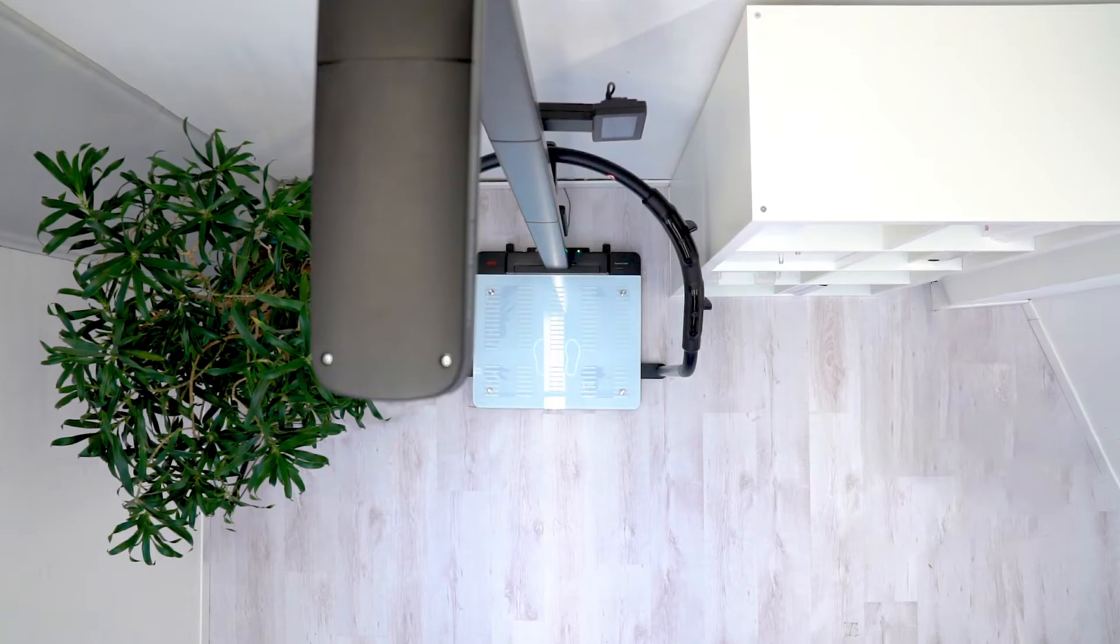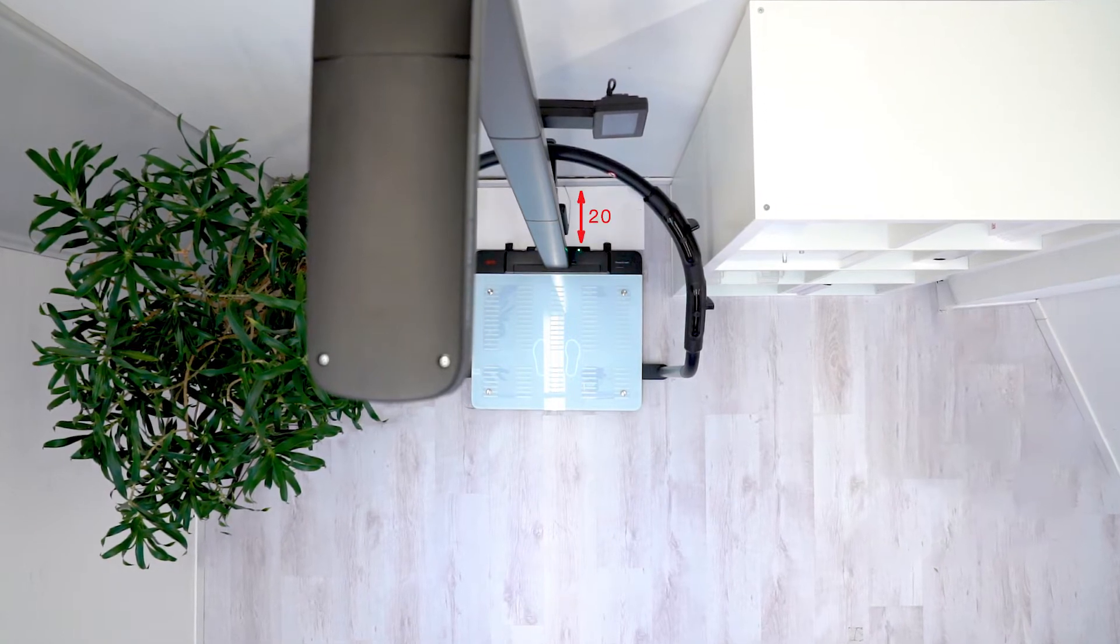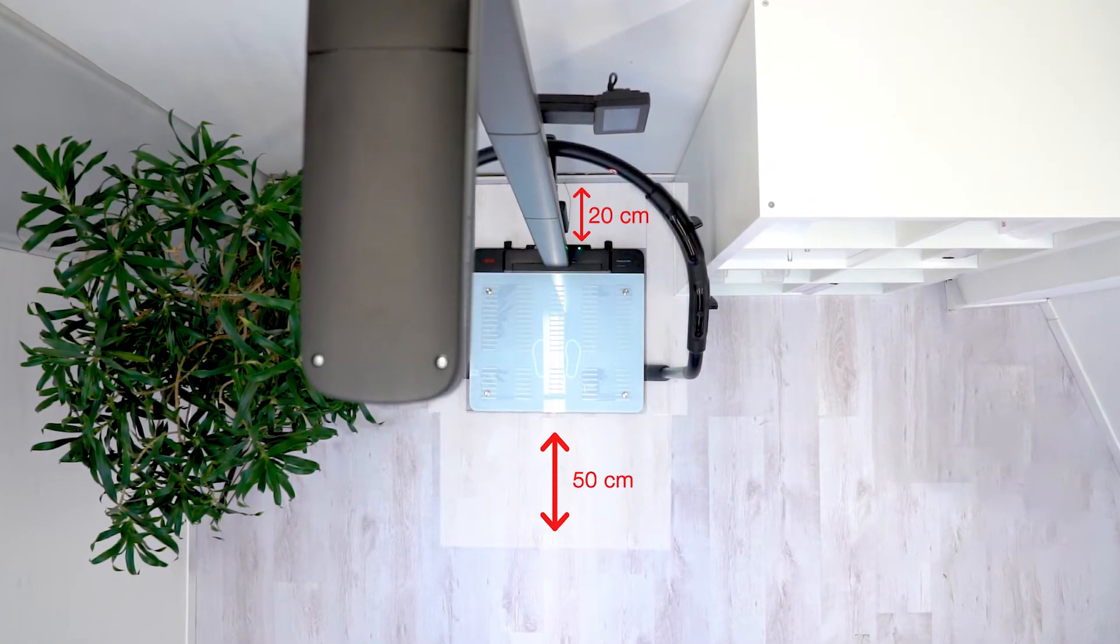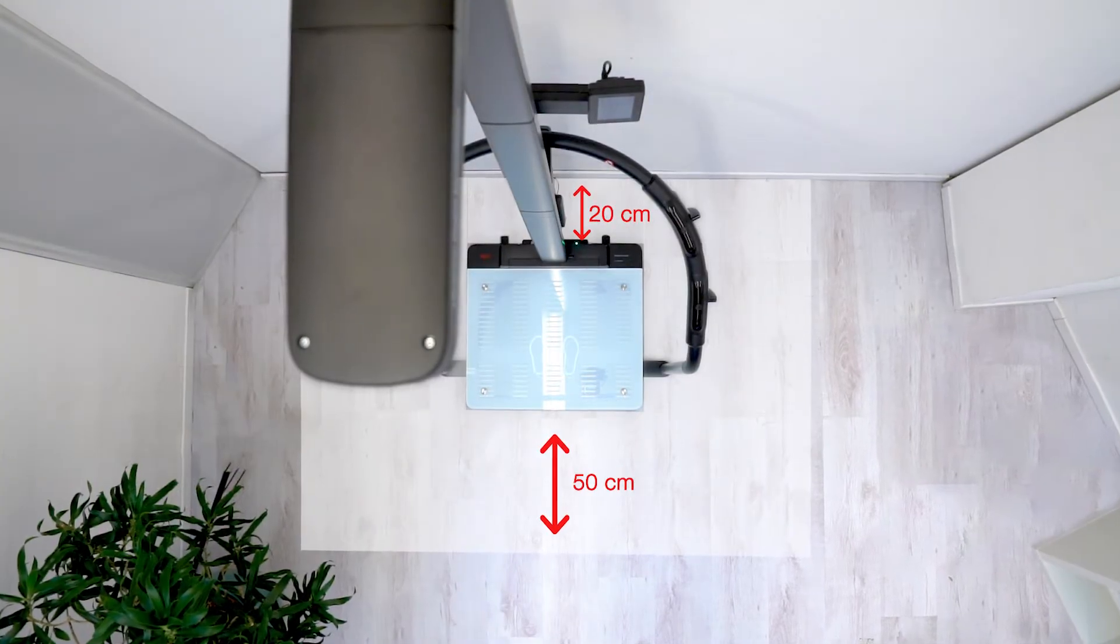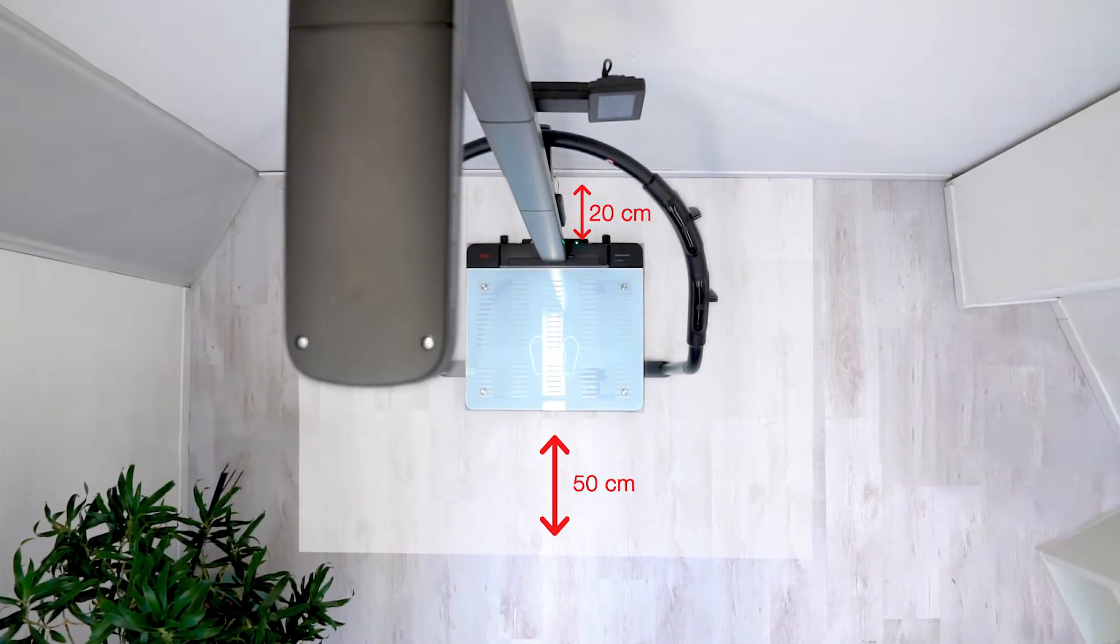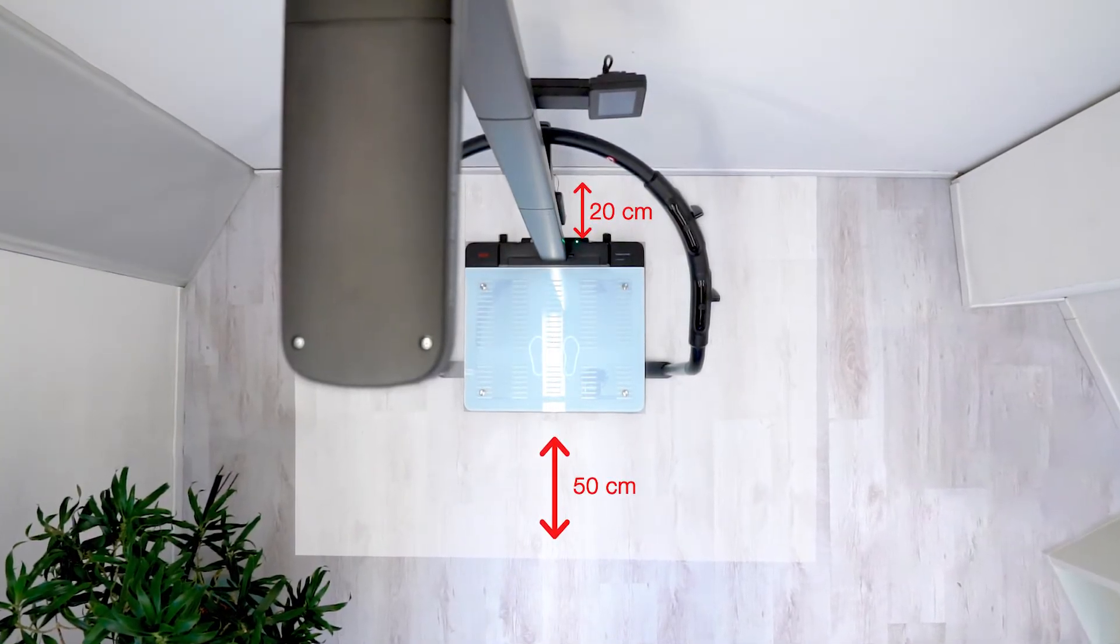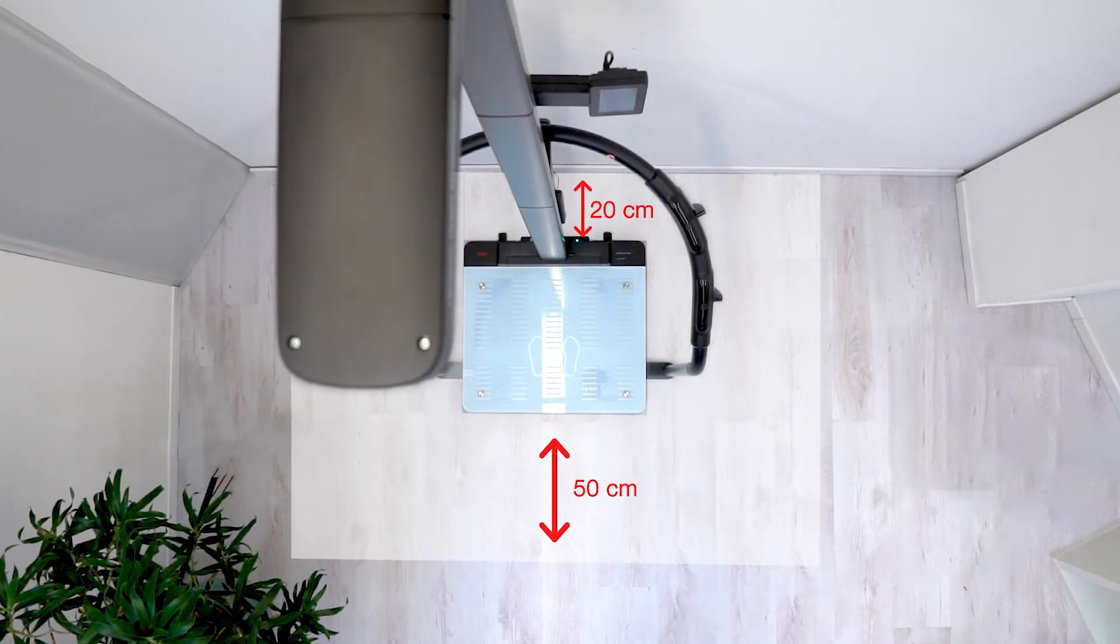Ensure that an area of 20 centimeters behind the device and 50 centimeters in front of and next to the device is left clear so that the ultrasonic height measurement can achieve perfect measurement results.